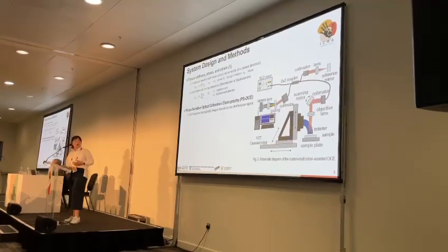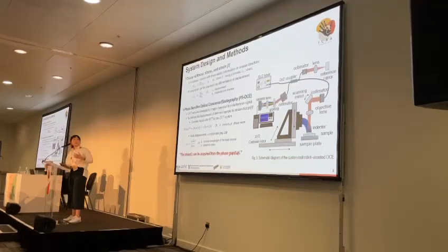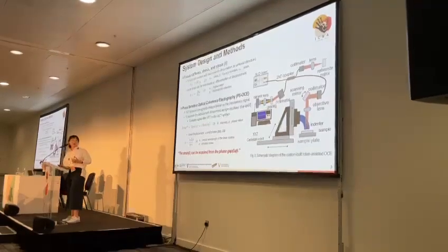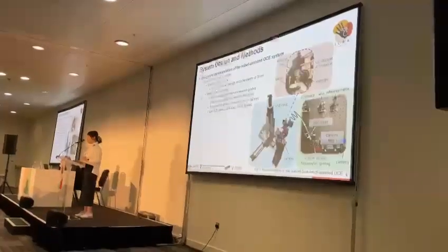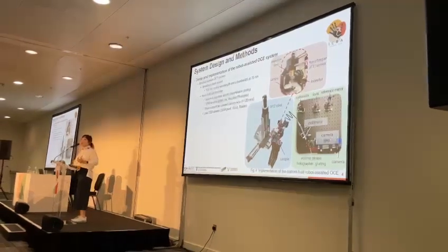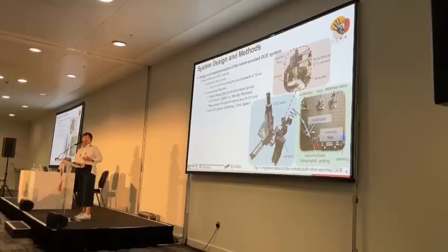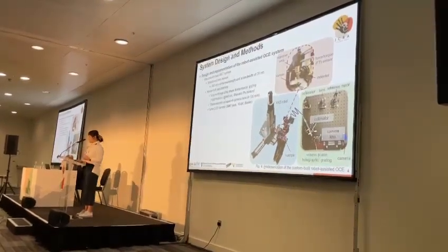OCT acquires tomography images based on an interference signal. The OCT signal after Fourier transform is a complex number that contains a phase term. The strain can be acquired from the phase gap between OCT frames. This SD-OCT system in OCE uses a broadband laser source as a light source and adopts a home-built spectrometer for detecting and processing the spectral interference signal.